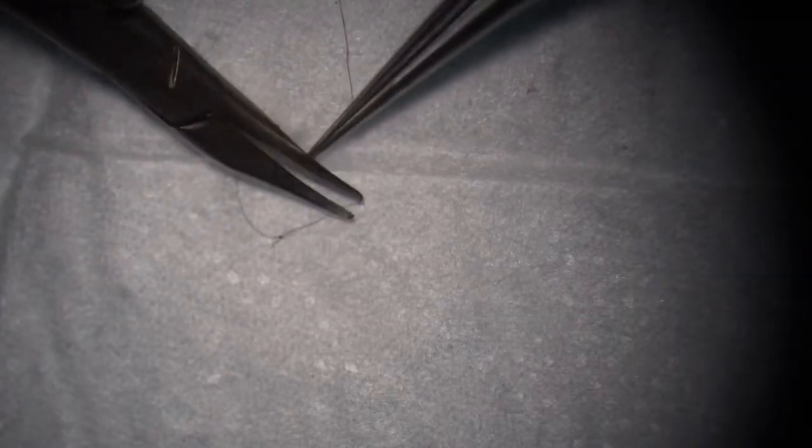And then second, if we have to clock our instrument, usually you may see the teacher just pulling it up and down instead of completely clocking. And then the third knot, if we didn't pass the suture, we can just go left and right. But in the training, we pass the suture. We want to train both our hands, improve the dexterity of both our hands. So in the training, when we are still learning, pass the suture to practice both of our hands.